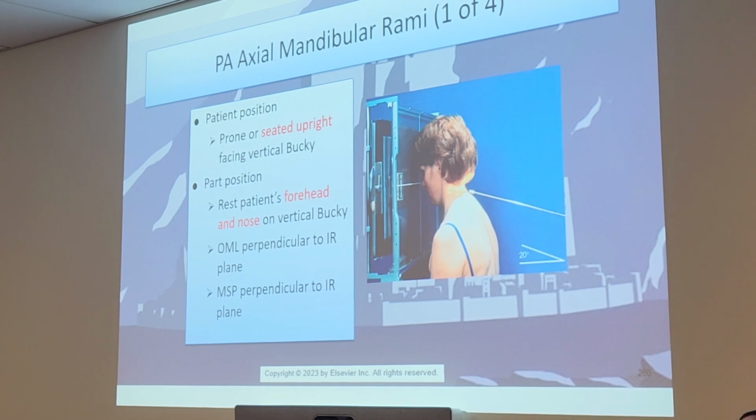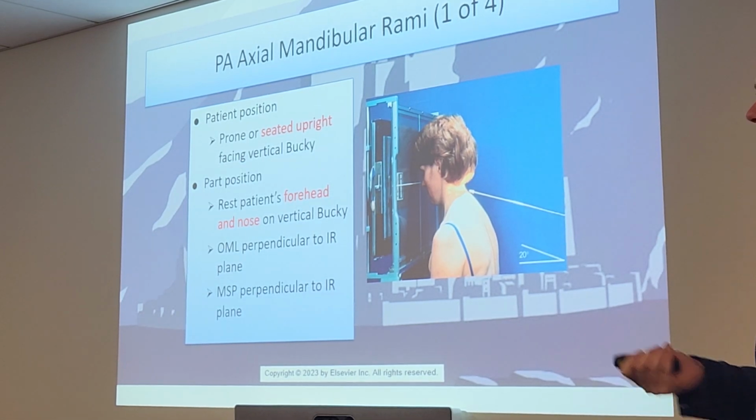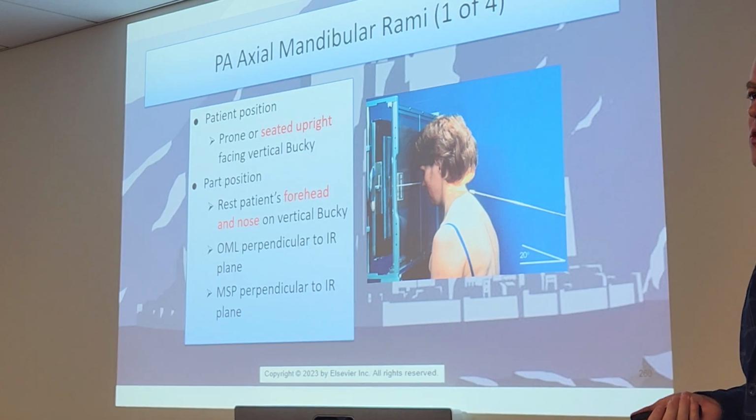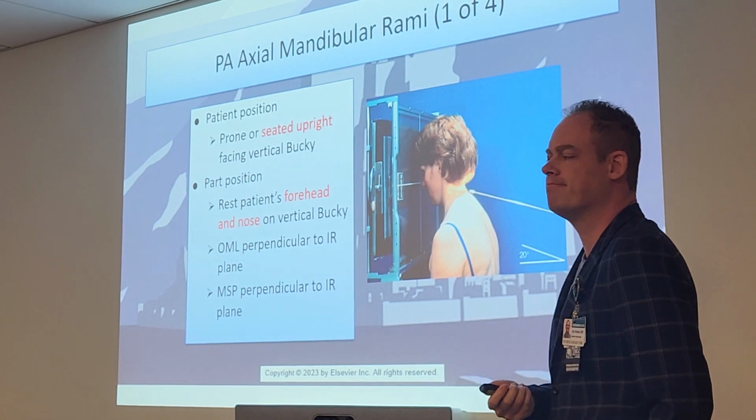Yes? So is it imperative that we do upright, or do they have to be seated specifically? Either way, I just prefer to stand my patients up. That's just me. As long as they're upright, that's the ideal way. And that's seated or standing.